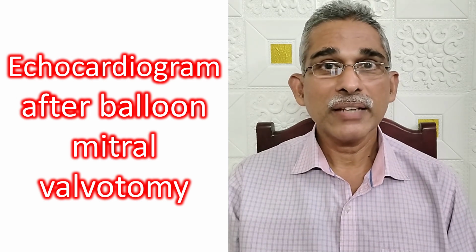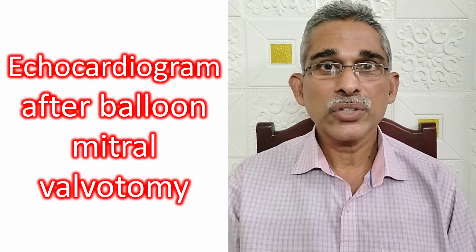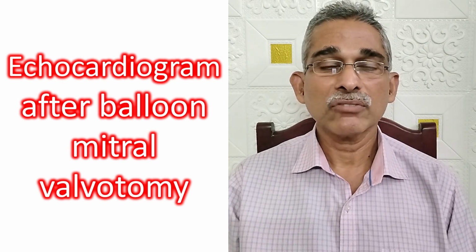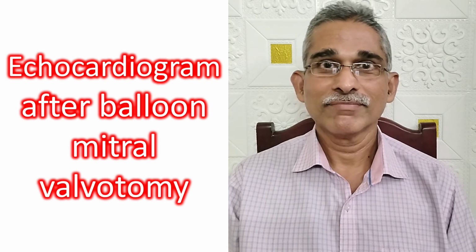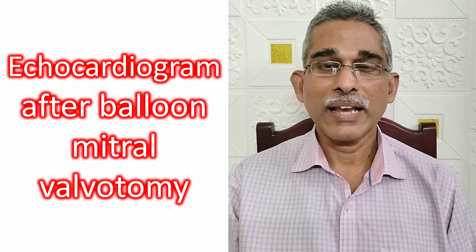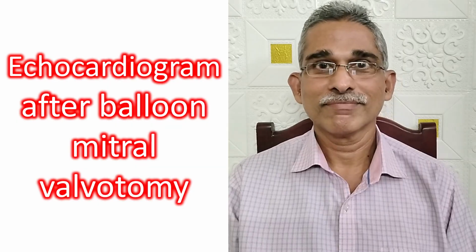That can be easily made out by an echocardiogram, and in case it is a significant effusion, you can put a transpericardial aspiration catheter and deal with the emergency as needed. That's why availability of echocardiogram in the cath lab for balloon mitral valvotomy is very useful.